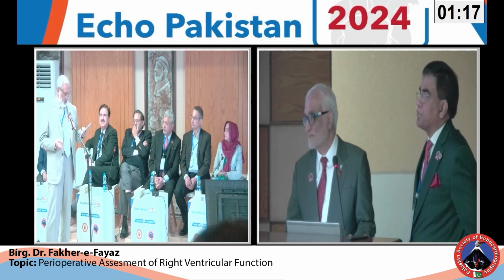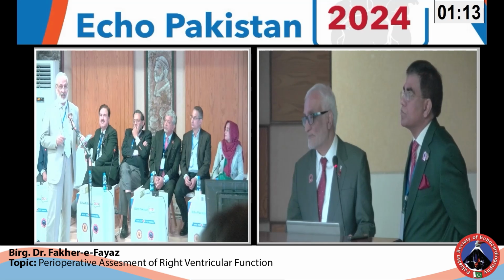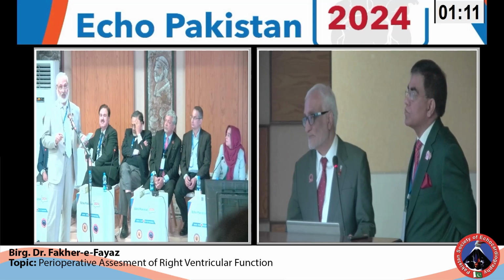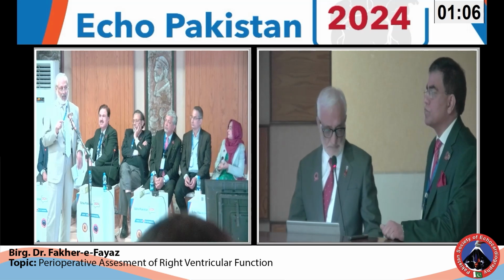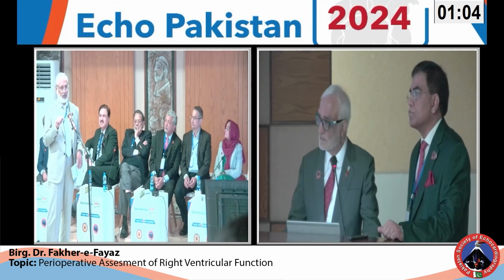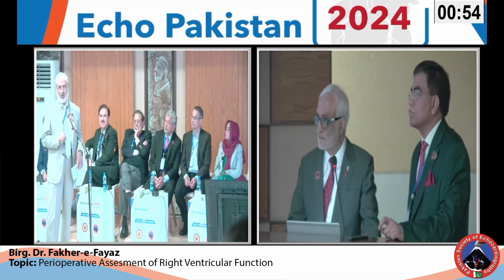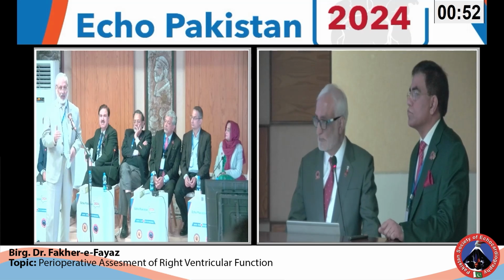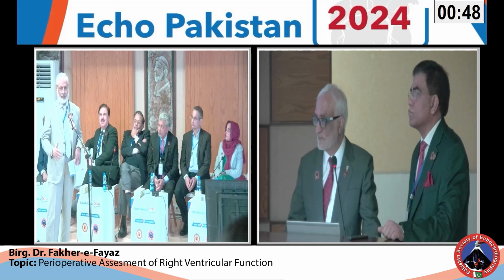And thirdly, you haven't mentioned the epicardial fat thickness. That affects RV function, and it is an important parameter now for the assessment of HFpEF. Last, IVC: I think this is an older slide, about 2001. IVC measurement, because of its irregularity, has been taken off, and now you have to mention TR velocity instead of adding RA pressure to it. I think I just read a paper about 2 or 3 months back.